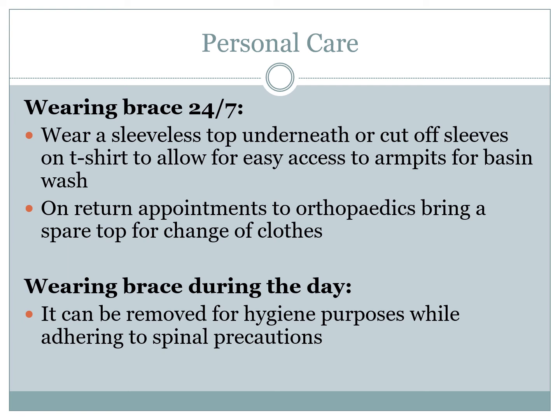In terms of personal care when the brace is to be worn 24/7, we would advise the patient to wear a sleeveless top under the brace or a t-shirt where the armpits can be cut out to allow for easier access to a basin wash. We would also advise the patient to bring a spare change of upper body clothes to their follow-up orthopedic appointment so that the orthopedic team can change their clothing when removing the brace for investigations.